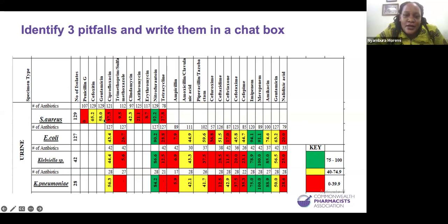I also expected people to pick up on cefoxitin, yeah. You have cefoxitin here. Remember, we said those surrogate tests, it's better to now put the one that should really be reflected, like oxacillin here.